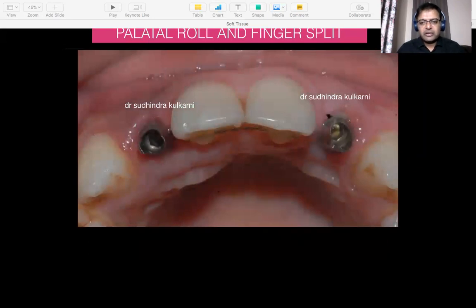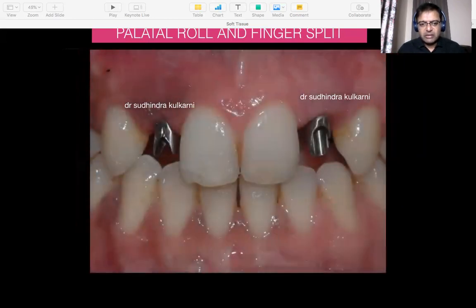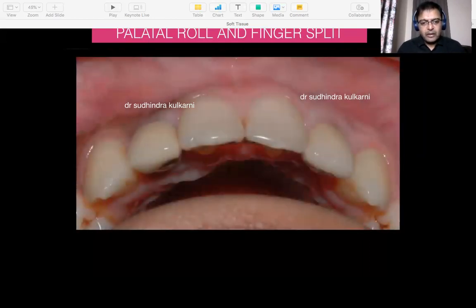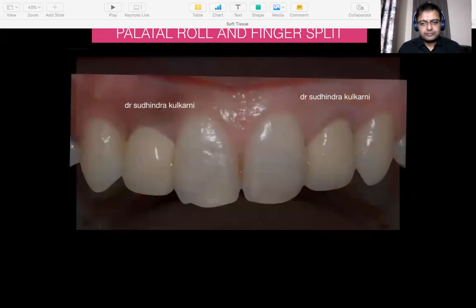And then eventually, once the final restorations are ready, this is the final abutments. And then on top of that, fit in your final restorations. Now, actually, you can see that on the side where we've done the tissue roll, a pedicle connective tissue, and on the side where we've not done that, you can see a stark difference in the amount of bulk of the tissue. Actually, now the 2-2 site actually looks far better than the 1-2 site. Okay, you can see that even in the contour.